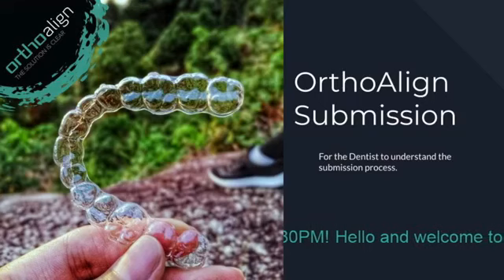Okay, always inspect the impressions before sending them. Like I said, any problems will be rejected. So it is important that you always inspect the impression. If you are not sure, you can always take a photo and send it over to us, or if you want, you can also pour the stone yourself on your side first, just to double check. If it looks good, then send it over to us.